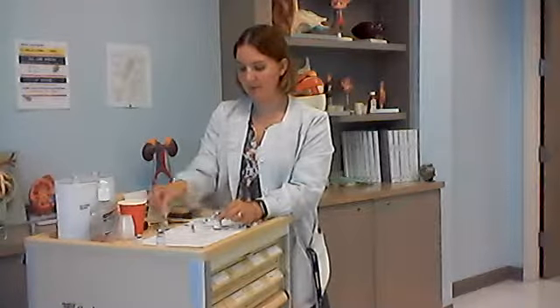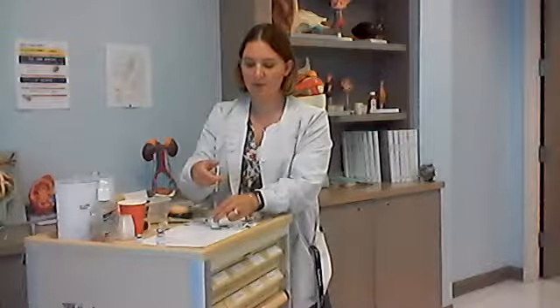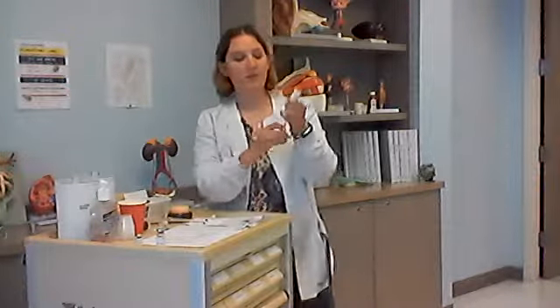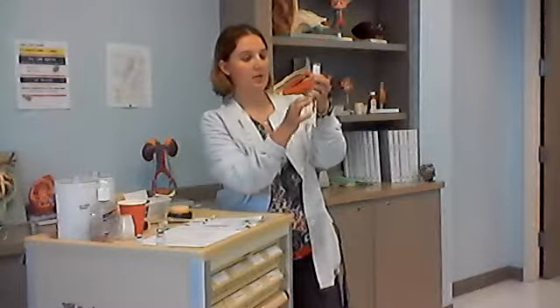Per your policy is whether you wear gloves when preparing medication. I'm going to say no, it's not my policy to wear gloves. However, you're more than welcome to. I'm going to clean the top of the vial off, and we're going to put our 0.5 of air into the vial, flip it over, and draw our medication out.